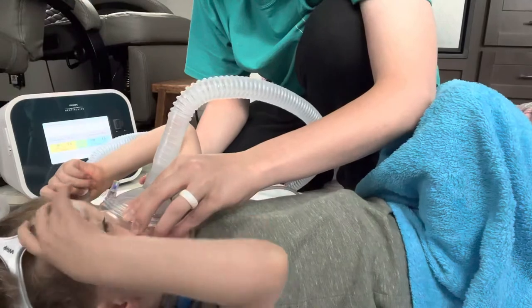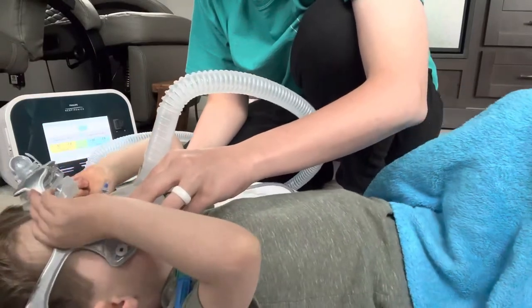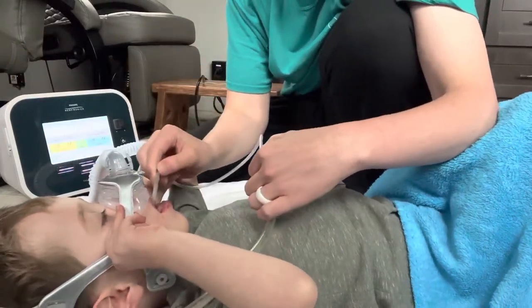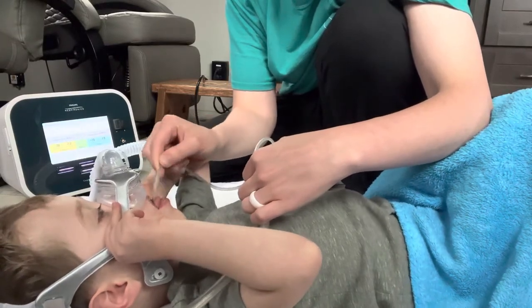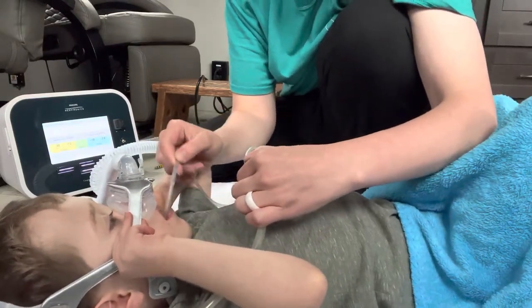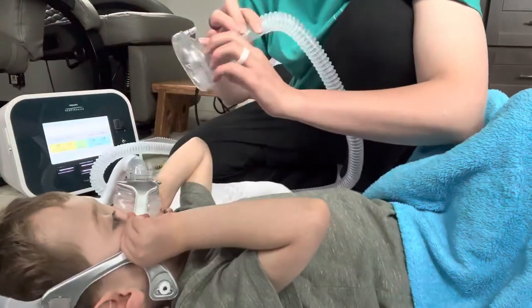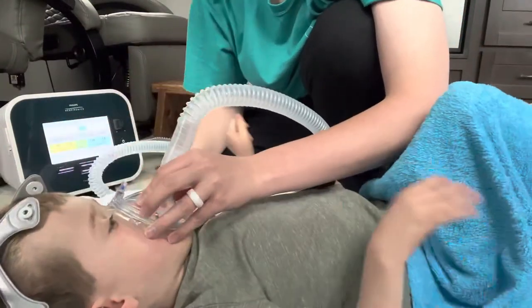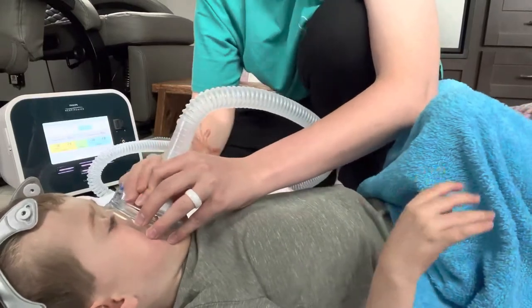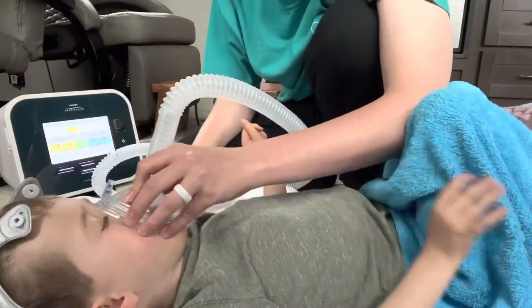About this one is that I don't have to, when we're breathing in, okay? Because I don't have to turn the therapy session on and off. It's just automatically triggered, so that's actually really nice. You can see I'm just not pressing buttons over here. It's just because we have a really new machine and we don't have to. In the hospitals that we have gone to, they actually have the really old school stuff, and so they'll actually manually have to do these settings and everything like this. So it's really nice to have a machine that's automatic.